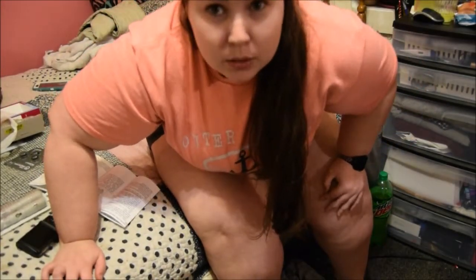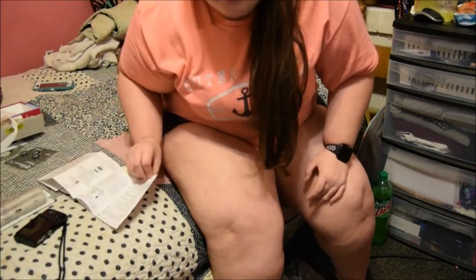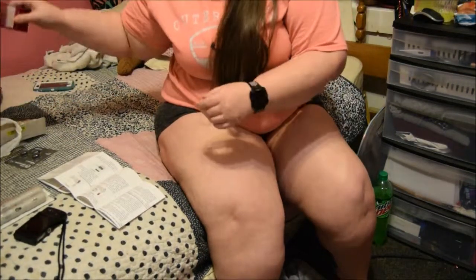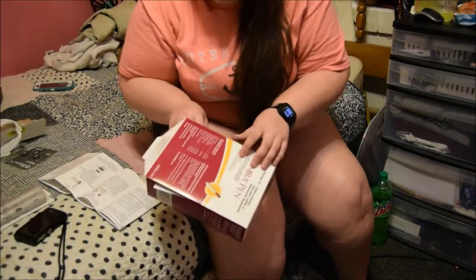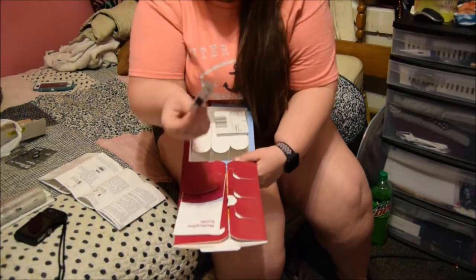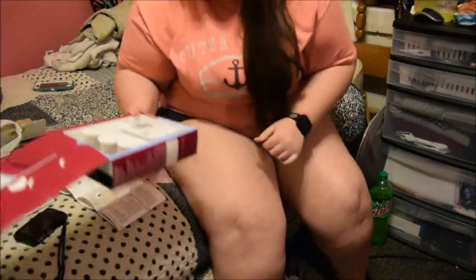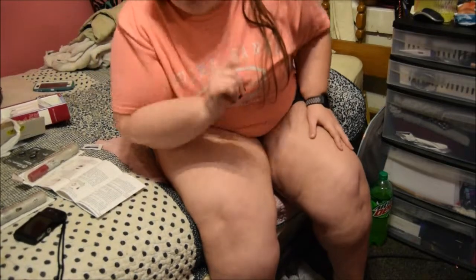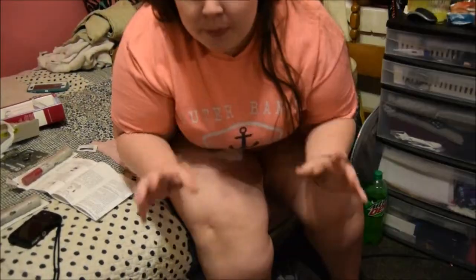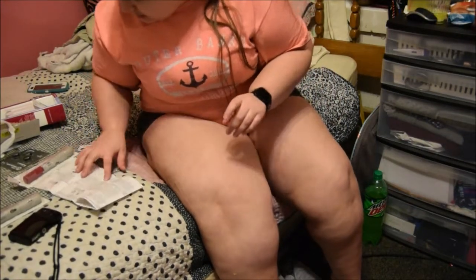Okay guys, so I have you guys set up now on my tripod because I'm going to do these injections. I'm going to kind of walk you guys through how I'm doing it. I'm also reading the pamphlet that it comes with in the box. This is the box that the Humira came in, so I just pulled it out. It's got some guides and stuff here. My alcohol preps are here, so I'm just kind of reading through it first, and then I'm going to go ahead and get started. What I'm going to do first is go wash my hands, actually, so I'll be right back. Okay, so my hands are good and washed now, so we're going to do that.